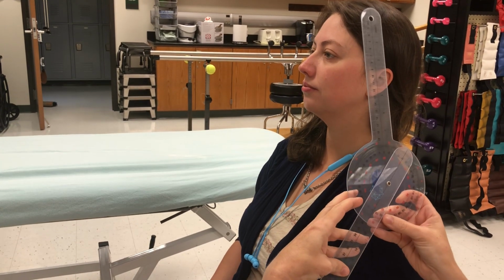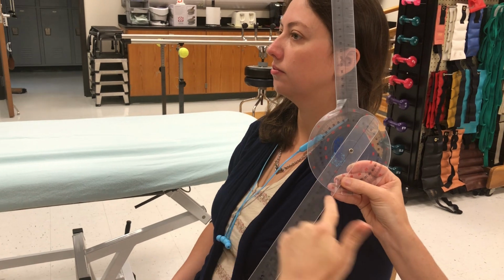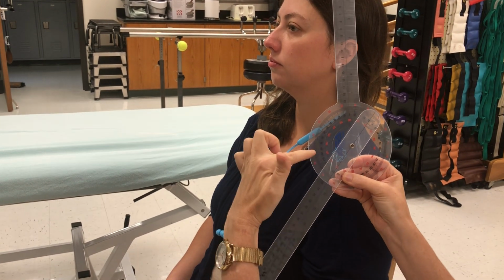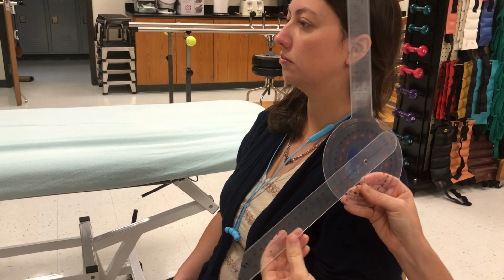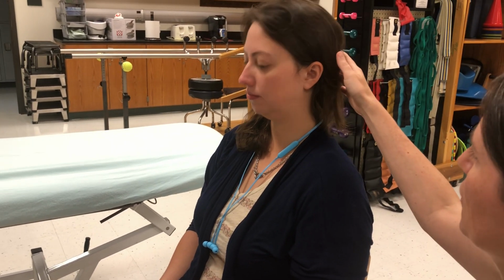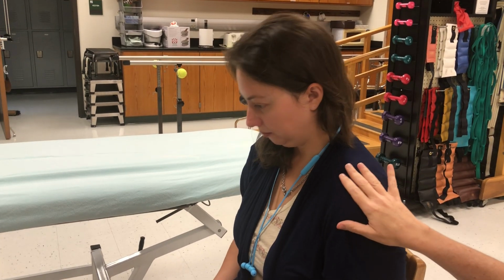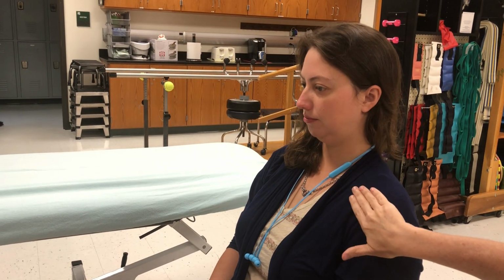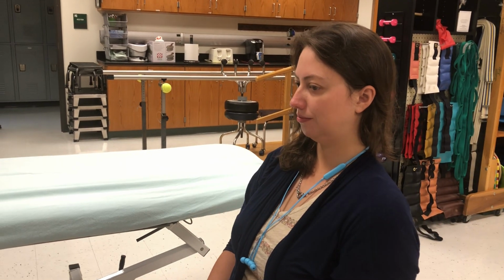And then I have 2 options. I can either read the red numbers because that's where the 0 is, so she's at 50, or I can do the black and do a little bit of math. So that was 50 degrees of cervical flexion. If she were to compensate, if she had limited cervical flexion, so do a little bit of cervical flexion, and she compensated by flexing the rest of her trunk, I'd give her verbal cues to keep her back up and maybe a tactile cue at the anterior shoulder just to help keep her trunk upright.